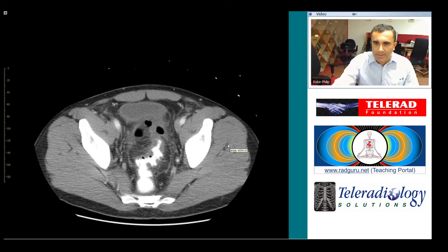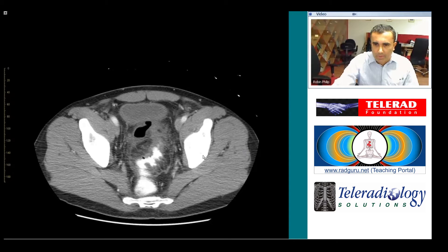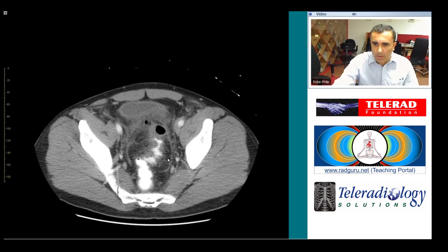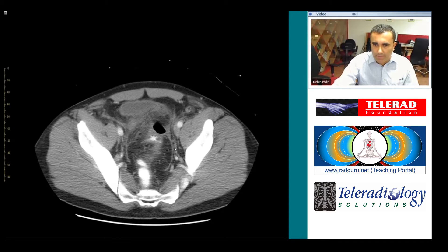Here's an interesting CT scan from the ED. Starting in the pelvis, you can see there is some thickening of the colonic wall and quite a bit of pericolonic fat stranding extending to the pelvic side walls.